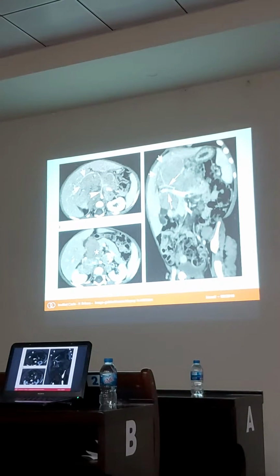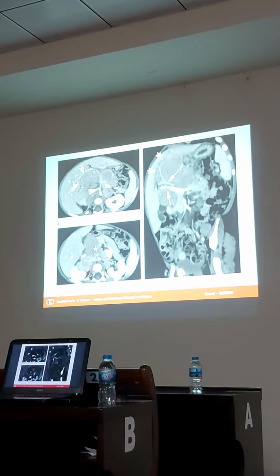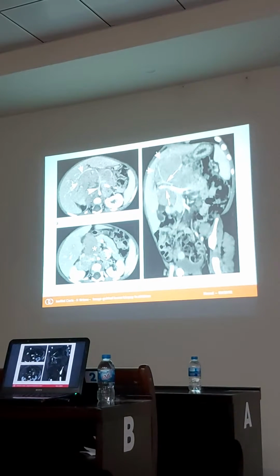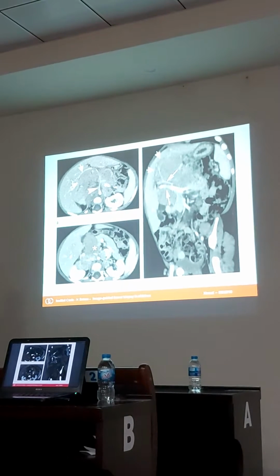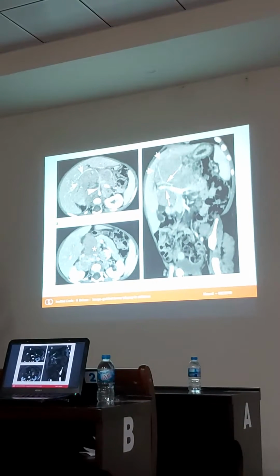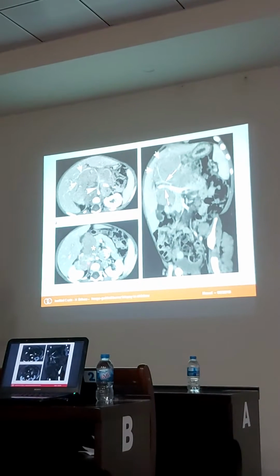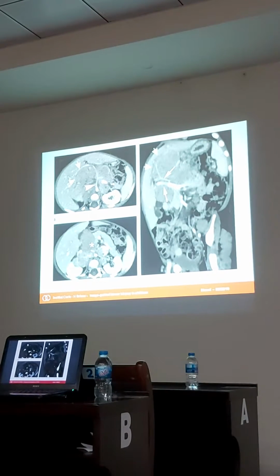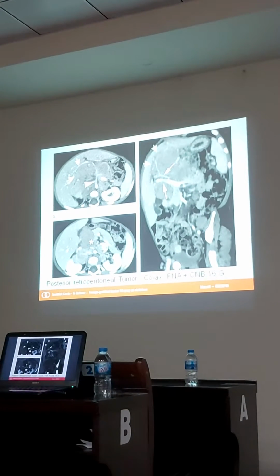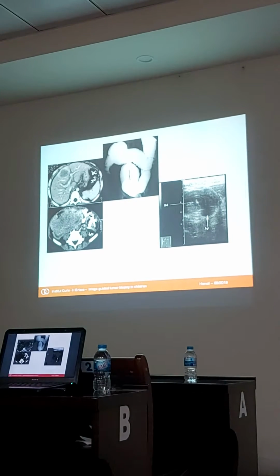So you will have to find the good pathway here to go, for example, in this area, but also avoiding the renal vessels. So you should be very careful with ultrasound Doppler to go exactly in this part. So it probably is the easier approach to perform the biopsy here. So you have to think about it before doing the biopsy, where is the appropriate tract. And we will do the same, fine needle aspiration and core needle biopsy.